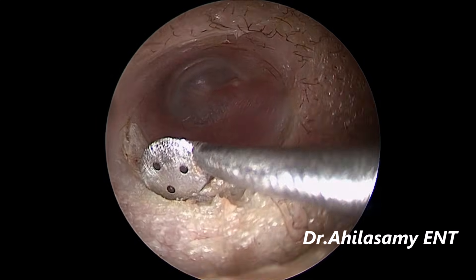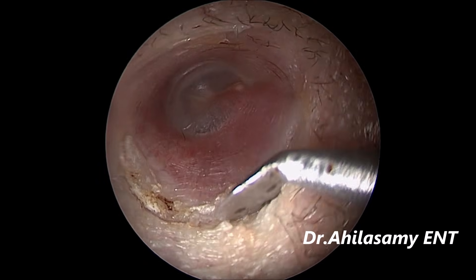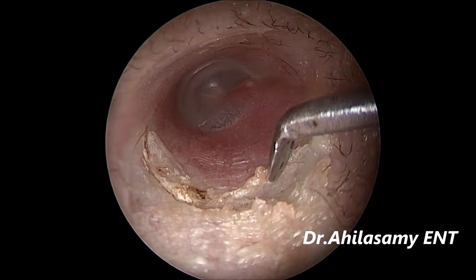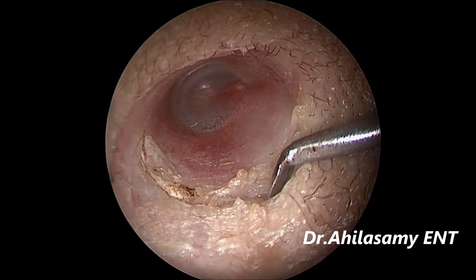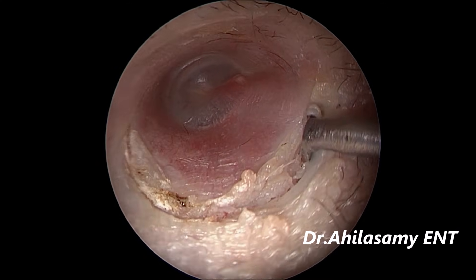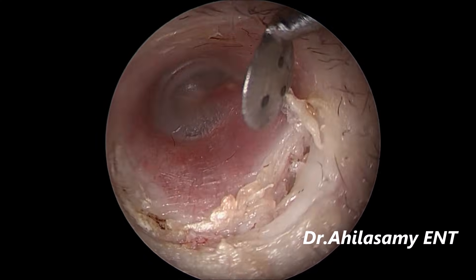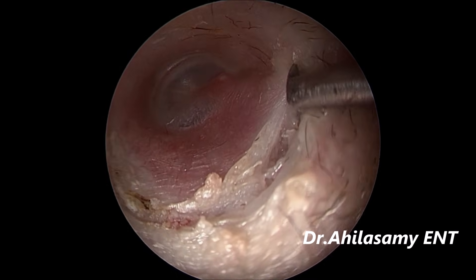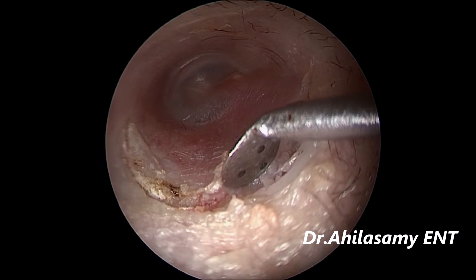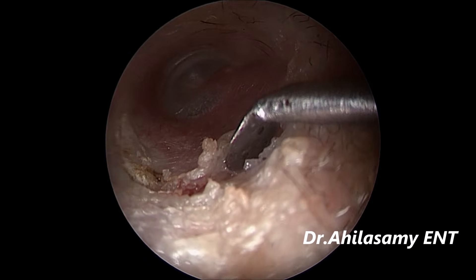After making an incision with the diathermy knife, I am elevating with the round knife. Either you can use the same knife or use an ordinary Rosen knife. Sometimes I prefer the ordinary Rosen knife because the diathermy knife has a cable attached to it which is a little bit heavy, and it is also a little bit costlier. So sometimes I use the routine Rosen knife for this.